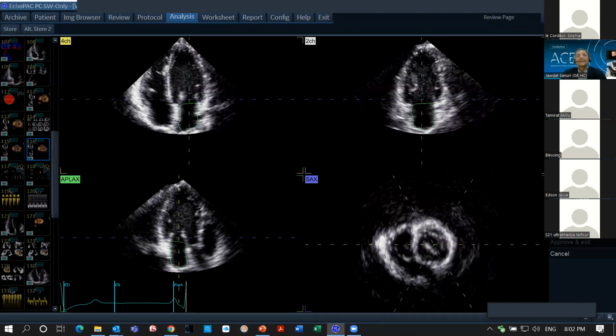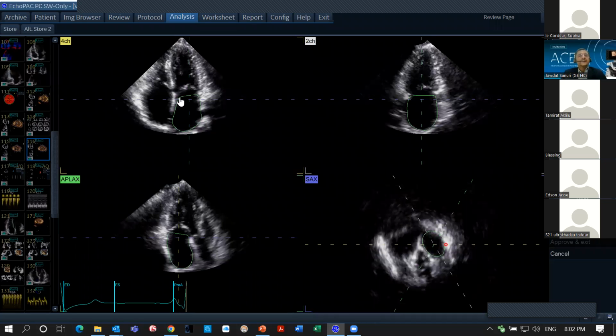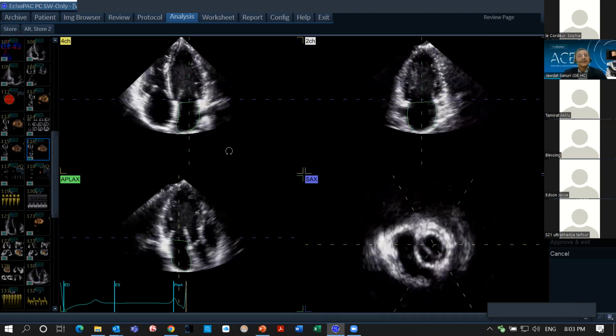So that was end diastole. Then I can go to end systole again, which is the actual end diastole of the LA, or the maximum volume of the LA. And again, you can see here, I can make adjustments for this speckle tracking to make sure that it includes the full volume and detects the best endocardial border. Don't forget, we're going to do strain. So we need to make sure that we are at the endocardial level and not inwards or not outwards. Then pre-A and pre-atrial contraction, again, try to make sure to include it all everywhere.